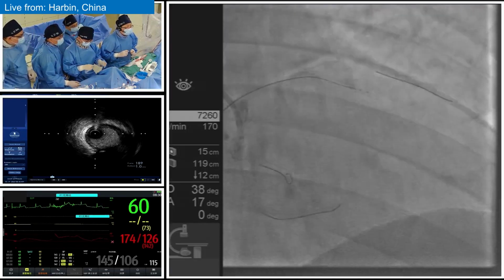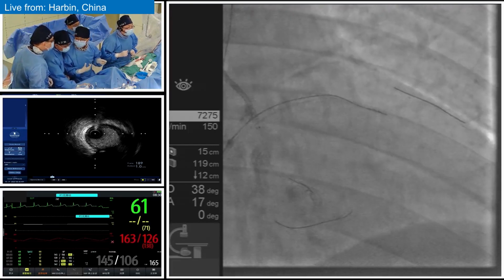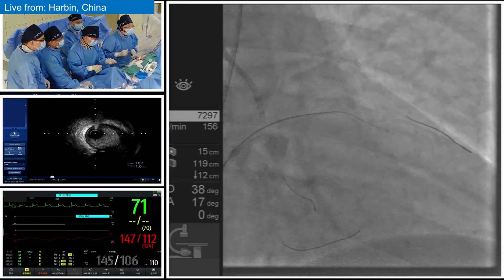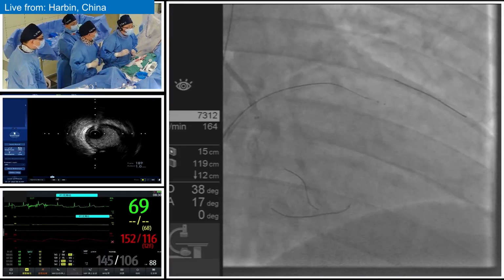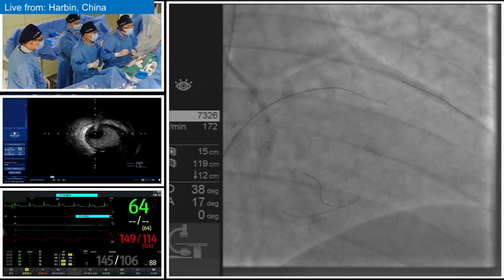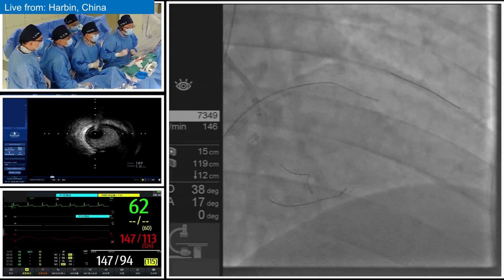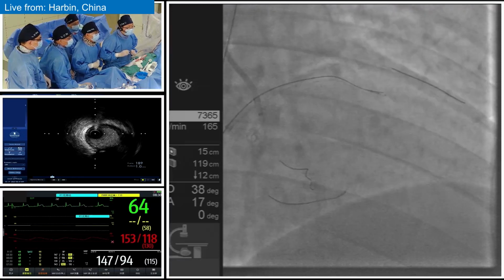A little bit of cough from the patient. And also another very key piece of information for the success of the ADR technique is the control of hematoma. We know that antegrade hematoma sometimes may cause some difficulties in the positioning and also the control of the Stingray balloon. Just like Professor Li introduced, as soon as we have successfully made the knuckle wire engagement, we need to avoid antegrade angiography to avoid any potential hematoma and dissections.